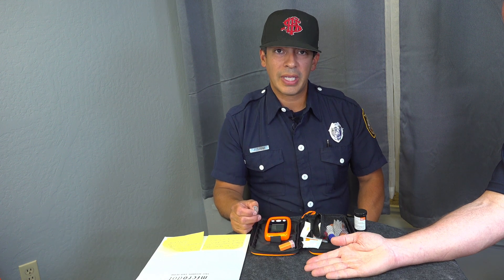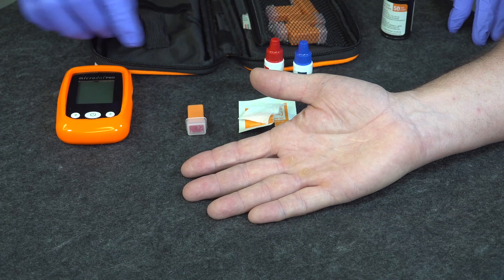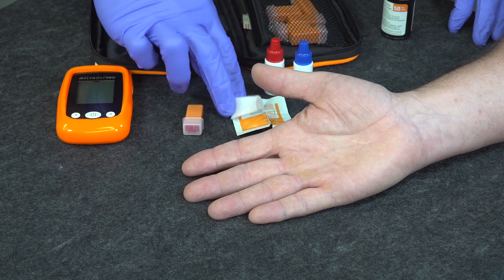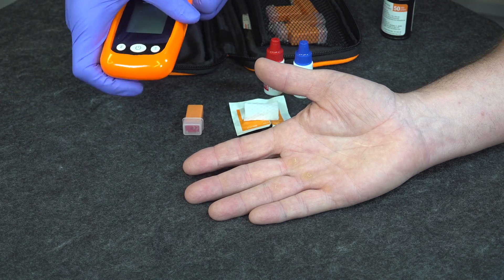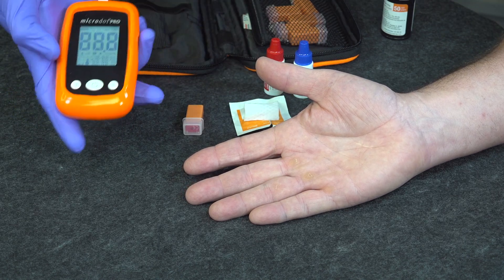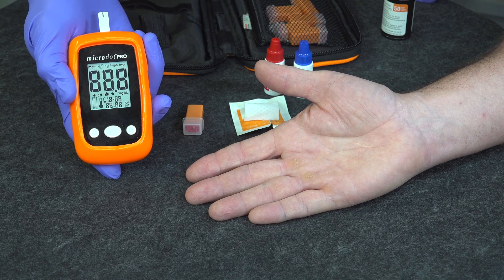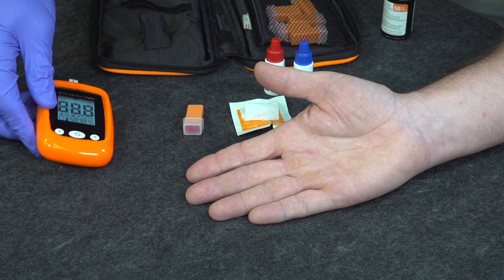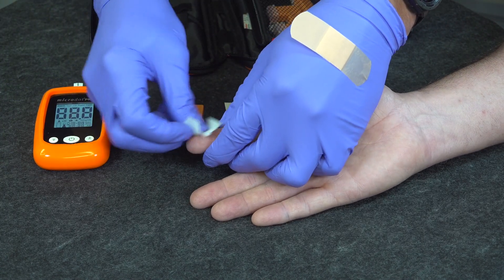In this section we're going to go through a live glucose test. I know you've already been doing it, but that way we're on the same page that operationally it works the same way. Get your lancet out, your alcohol prep, and your lancet ready to go. You're going to enter the test strip into the glucometer, wait for that beep so it activates, then go ahead and clean the finger you're going to test on.